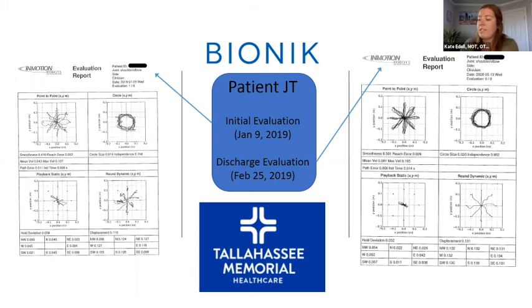The next one is going to go to both of you, but Sue, I'll let you address it first. He says, I'll be honest, documenting is the bane of my existence as a therapist. How do you take the data from the evaluation and those daily reports and then translate it into your documentation? So it is really easy. It sounds like it could be hard just looking at the metrics and things, but it really is simple.